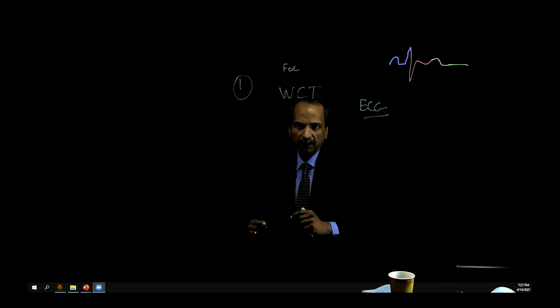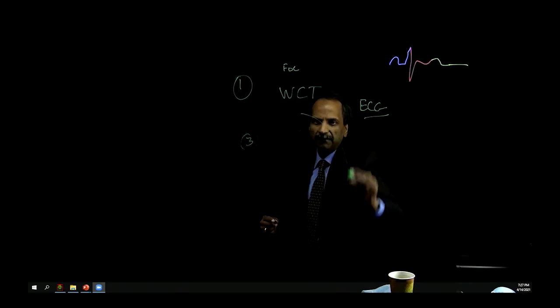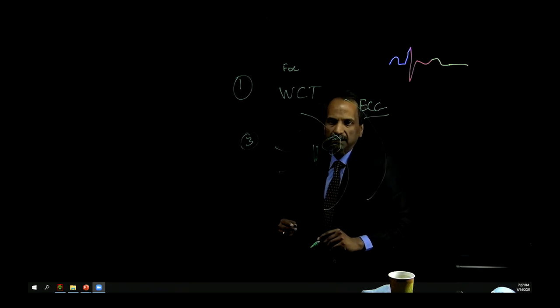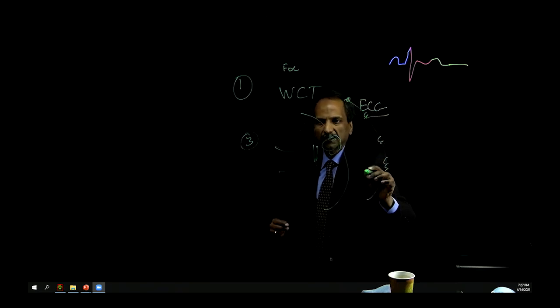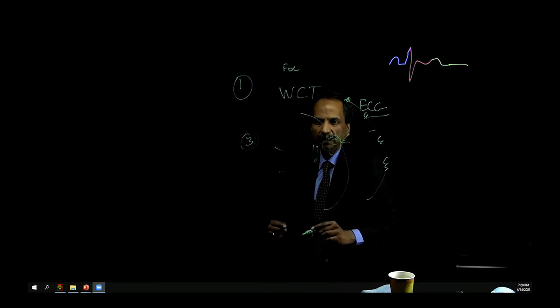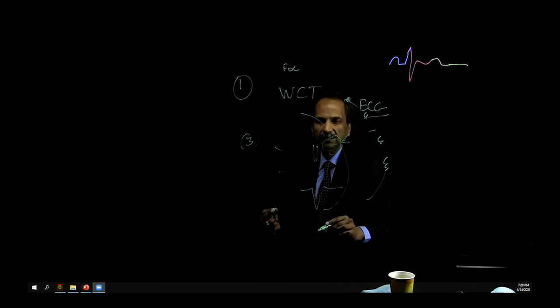The third is something that Abhishek pointed out, and that is, if you are recording from the internal surface, the endocardium, any source that's on the epicardium will always have some wavefront towards your roaming catheter. So it's impossible to get a QS complex. There's always going to be something that's moving towards this catheter.